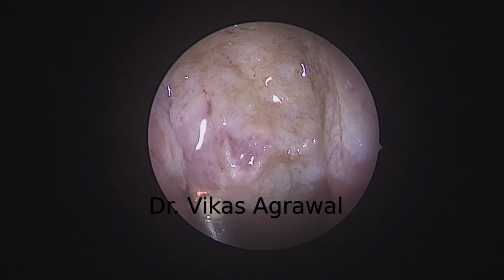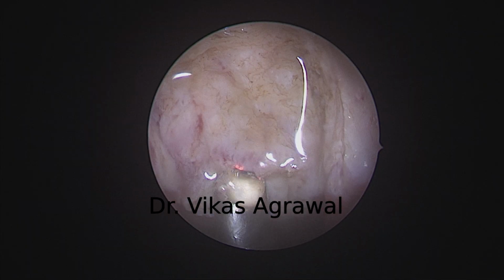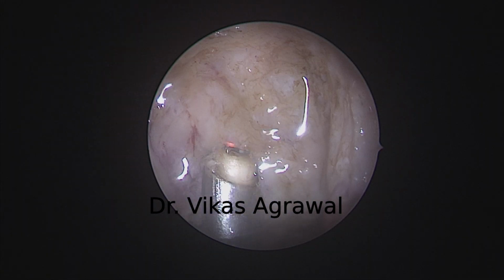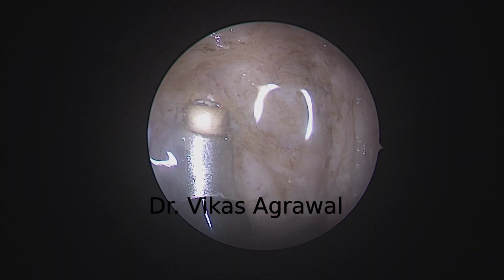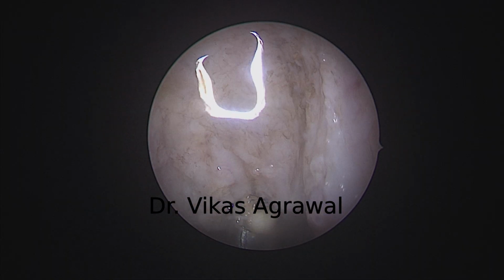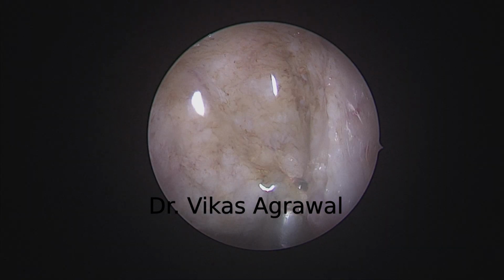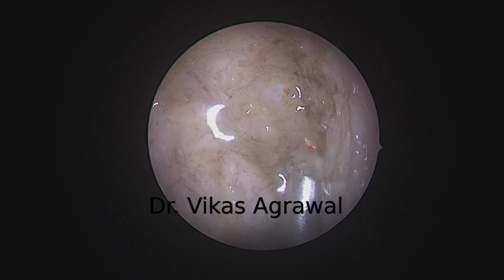So that's the last layer of the lymphoid tissue on the buccopharyngeal fascia. This is the Passavant ridge in the lower part, and I'm defining the buccopharyngeal fascia everywhere.